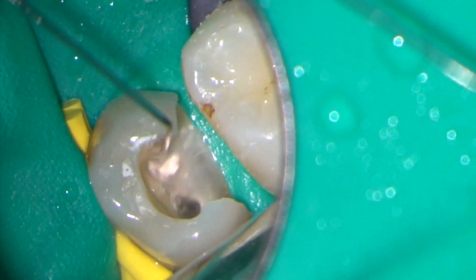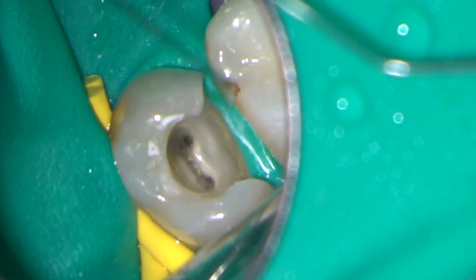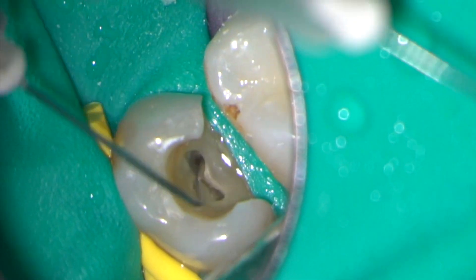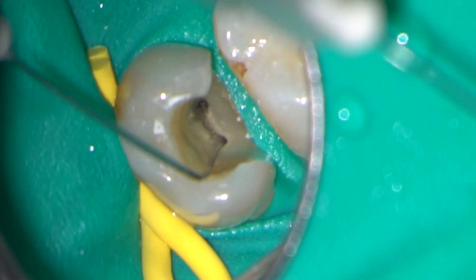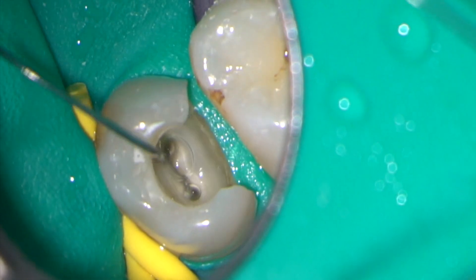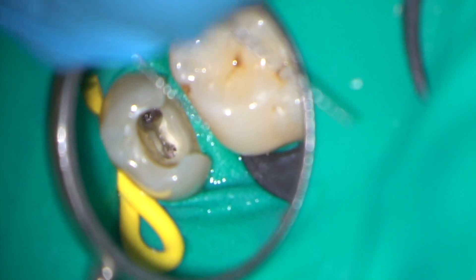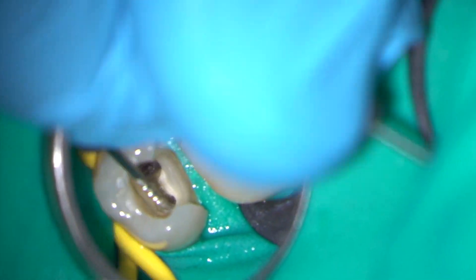As always, I am using copious irrigation with 3% sodium hypochlorite throughout the preparation. A size 30 Hedström file can be used to retrieve GP from deeper in the root canal system.